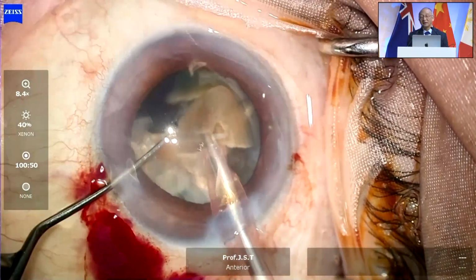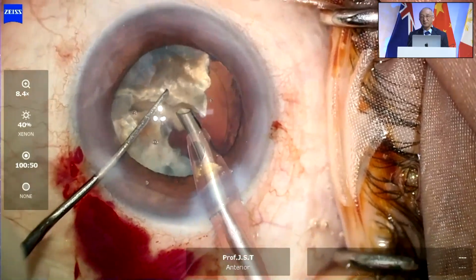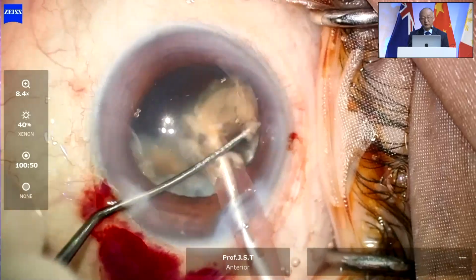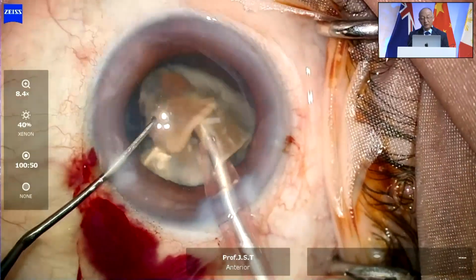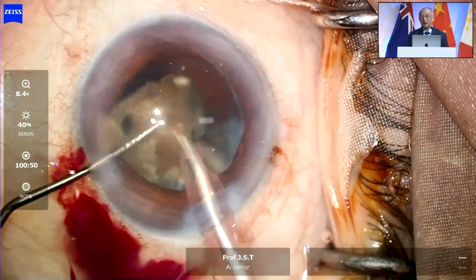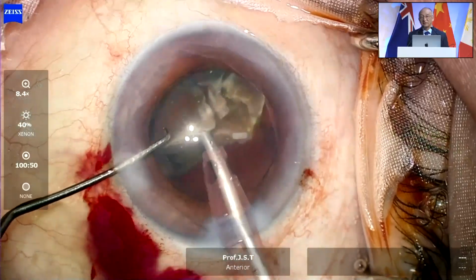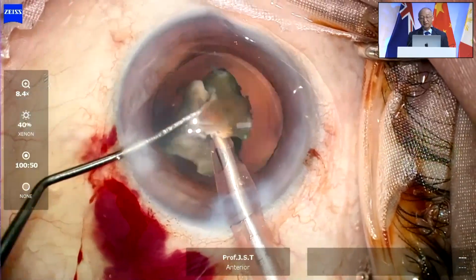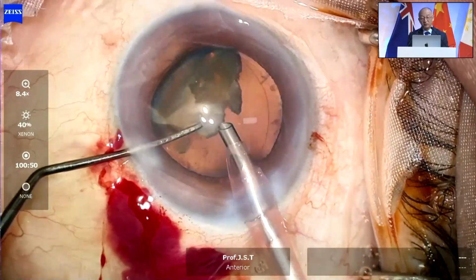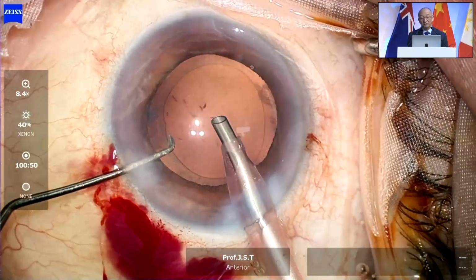In hard cataracts, the major difficulty is breaking the central area. Despite making a deep trench, sometimes it is very difficult. Cracking becomes difficult, chopping becomes difficult. So this simple addition of using pre-chop techniques can decrease the time of emulsification, the energy, and effectively less damage to other intraocular structures like the corneal endothelium. Wound burn, everything can be decreased now.